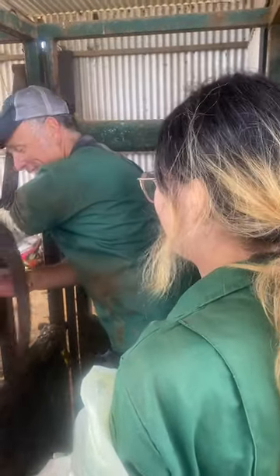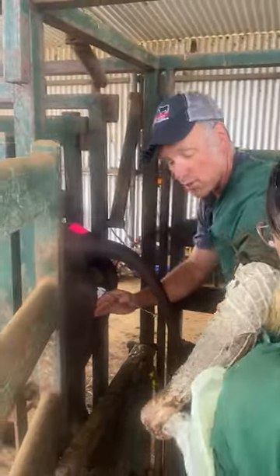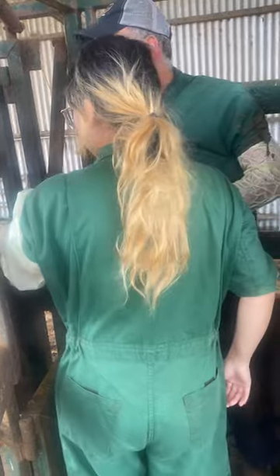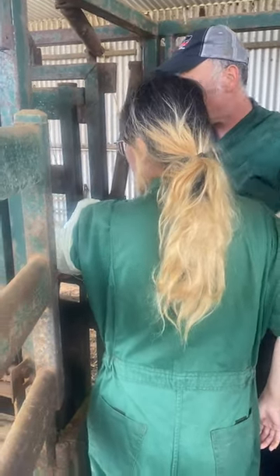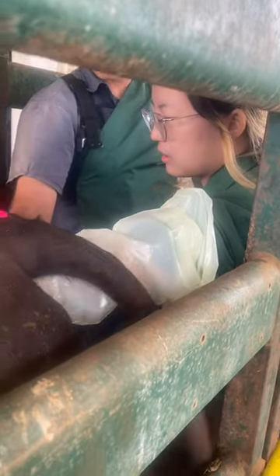Does that make sense? Vaguely, a little bit. So I've got it in the right spot for you. A little bit of hand — pull on your hand, natural lube, all organic. Slide your hand in the top hole, in the bump, that's right. Twist as you go in, kind of like a fork but in reverse. Can you feel the firmness of it? That's right, through the vagina.